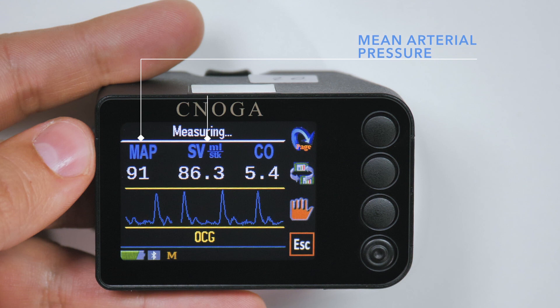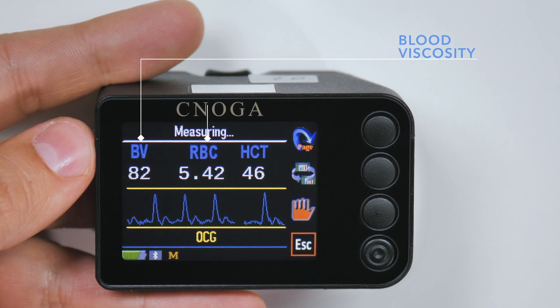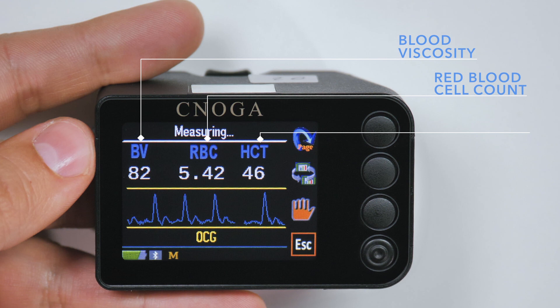Additional parameters include mean arterial pressure, stroke volume, cardiac output, blood viscosity, red blood count, and hematocrit.